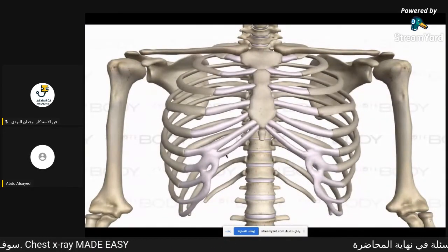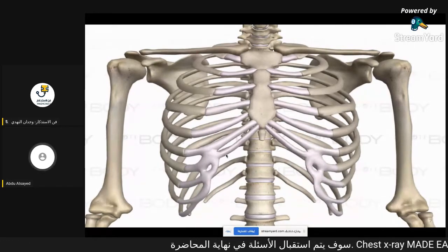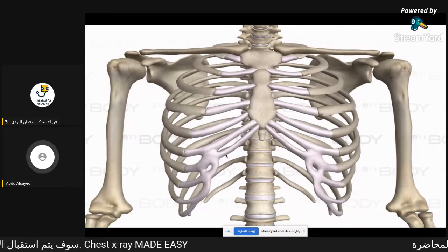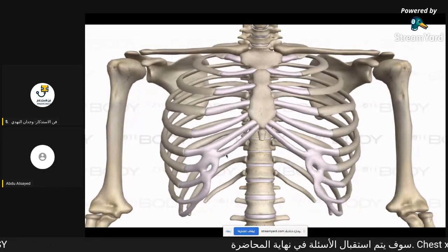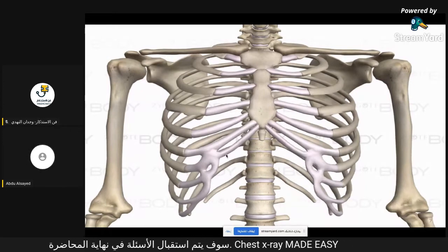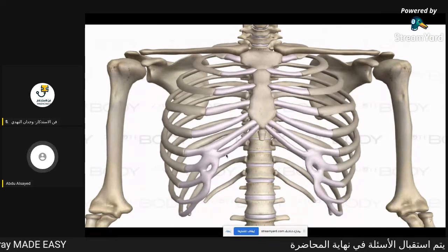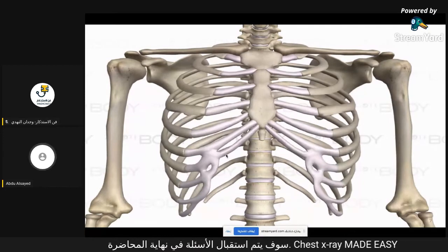The majority of residents, interns, and medical students say multiple times, how about the chest X-ray? We are not catching a lot of stuff from it. We are not getting any benefit from it. Let's do a CT scan for that patient. Let's do a CT chest. It's going to give us a lot of value, a lot of results. But we cannot scan a lot of patients.